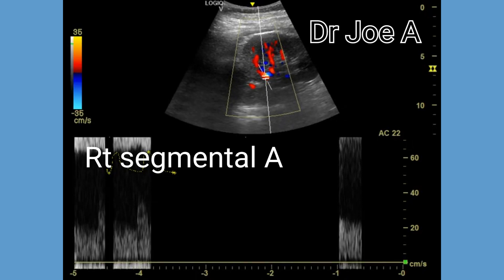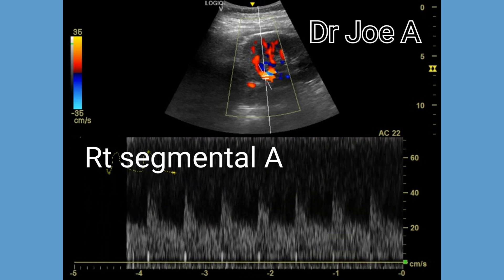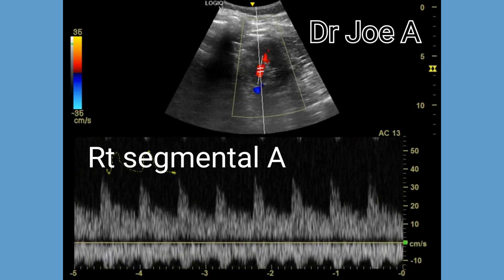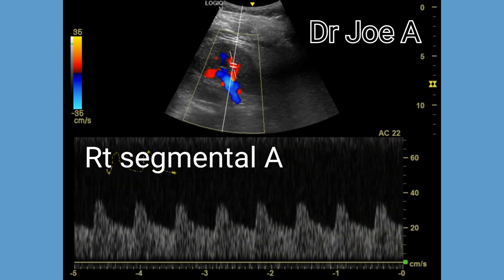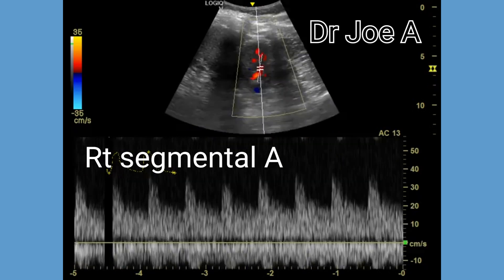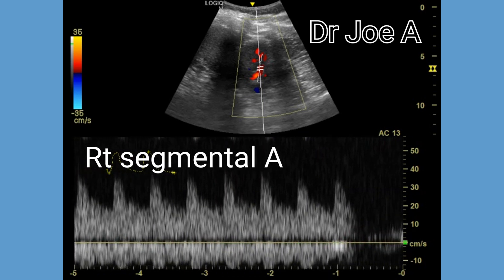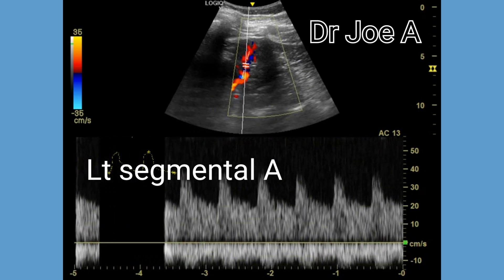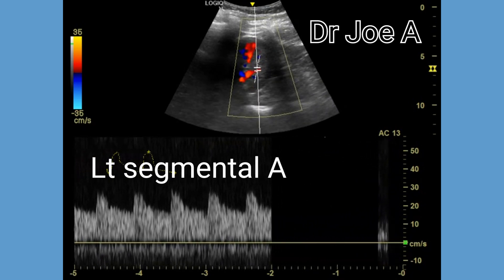Now we examine the segmental arteries, which are branches of the renal artery. The waveform of the segmental arteries typically shows just one peak, which is the systolic peak. The diastolic flow in the segmental arteries is usually low compared to the renal arteries. A higher resistance waveform in the segmental arteries could be an early sign of renal dysfunction or other renal pathologies. The left kidney also shows normal segmental arteries with a normal waveform.